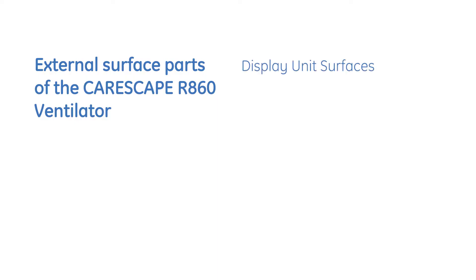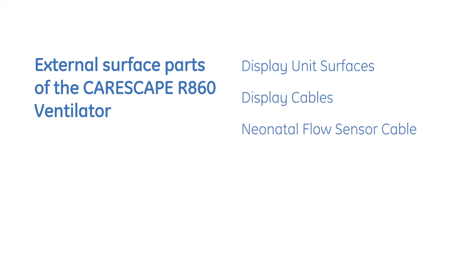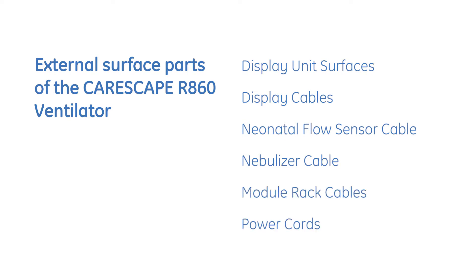These are display unit surfaces, display cables, neonatal flow sensor cable, nebulizer cable, module rack cables, and power cords.